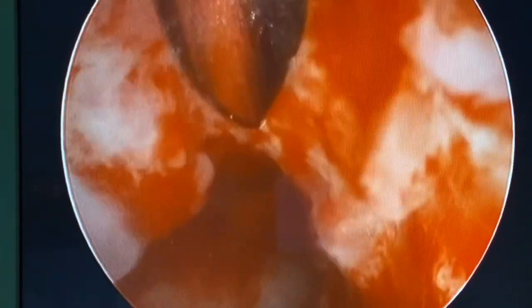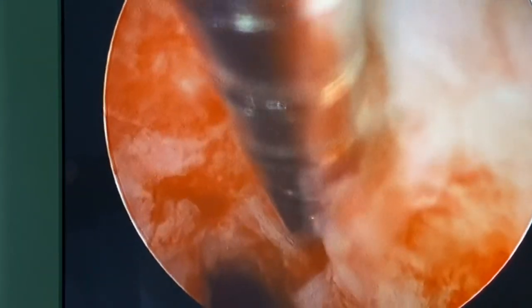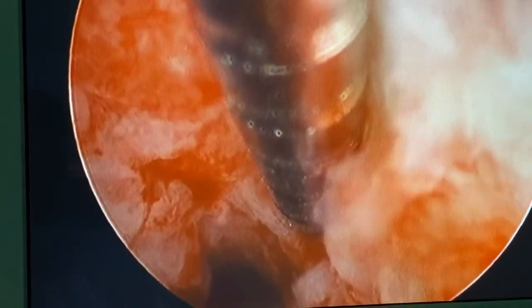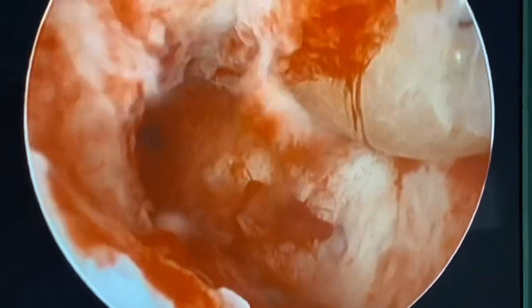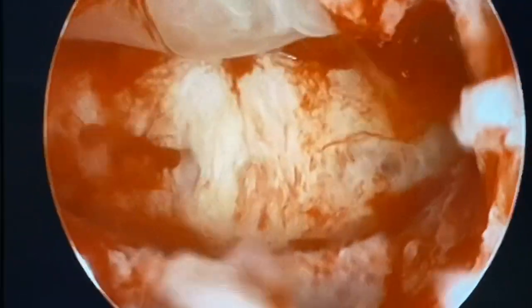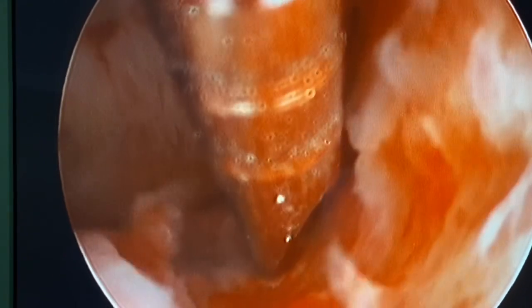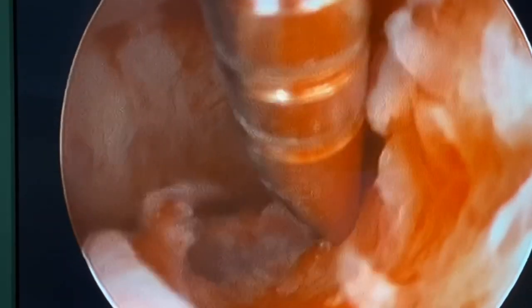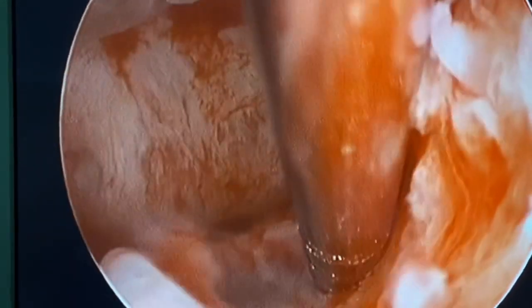I want to inject here as well. You can see the swelling. Some leakage happened, so we choose another injection point. This is sub-endometrial PRP injection — you can see the swelling clearly.